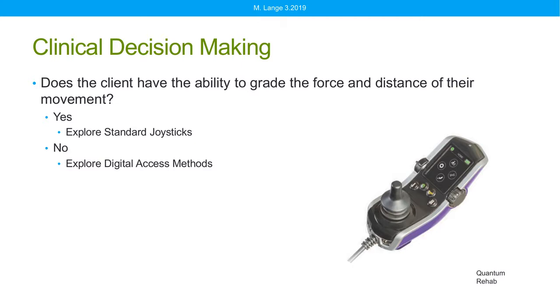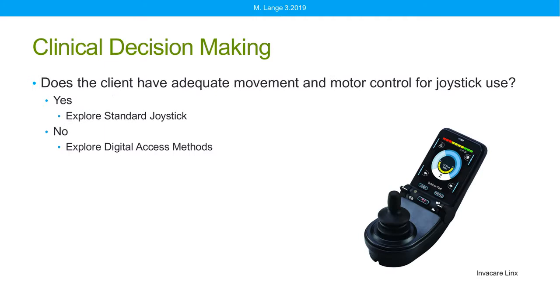So if the client does have this ability to grade the force and distance of their movement, they may be able to successfully use a standard joystick. If not, we typically have to look at digital or non-proportional options.